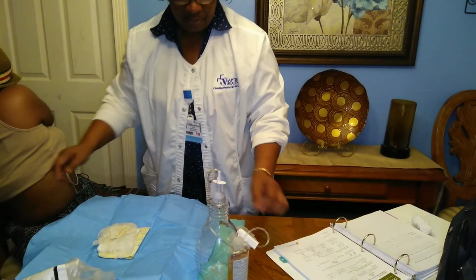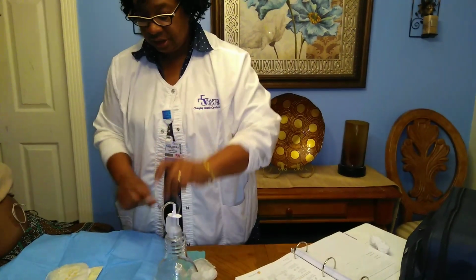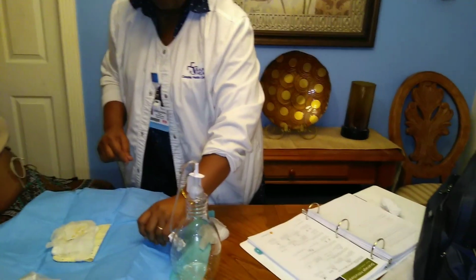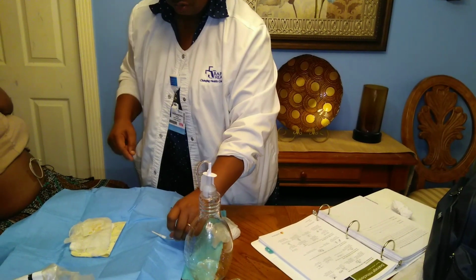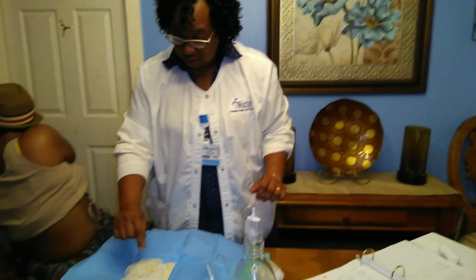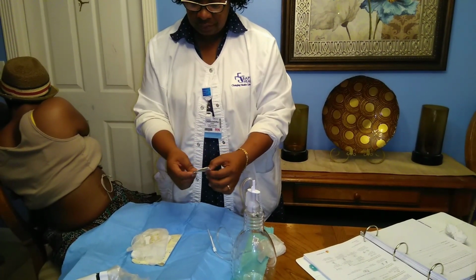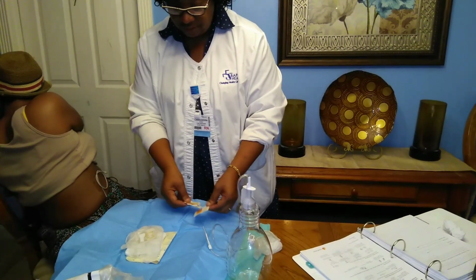I usually take my bottle, and when I take this tip, I usually take this and place this just a distance away from my sterile field, because this part is sterile. I place it here on my blue sterile field. I go ahead and open up my alcohol pads. There are 3 of them. I open them and I place them away from my sterile field here.